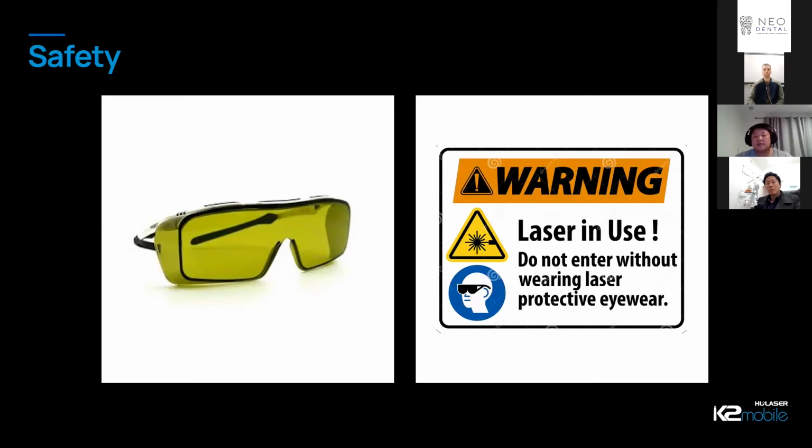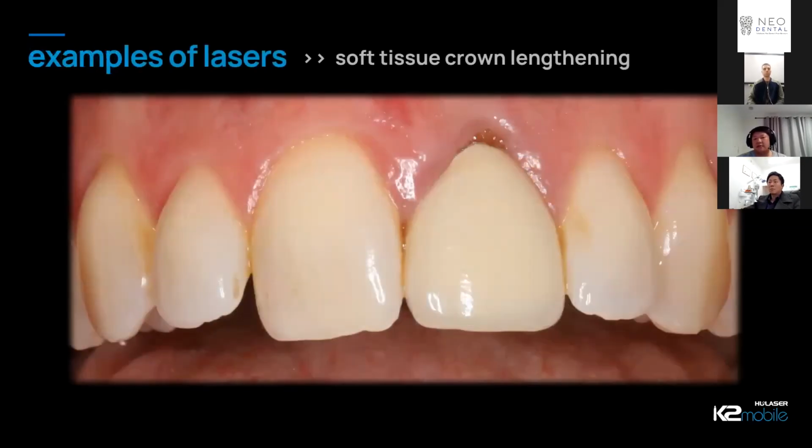And obviously the safety glasses are all supplied when you purchase the K2. I believe there's 3, so a pair for you and your assistant and one for the patient as well. One of the tips that I have is, if you have a very compliant patient, I find sometimes that I just tell them, hey, look, we're using a laser, it's damaging to your eyes, and they've already got our safety glasses on and they're happy to keep their eyes closed. That's what I have found with some of my patients, but wherever possible I do try and place the safety glasses on.